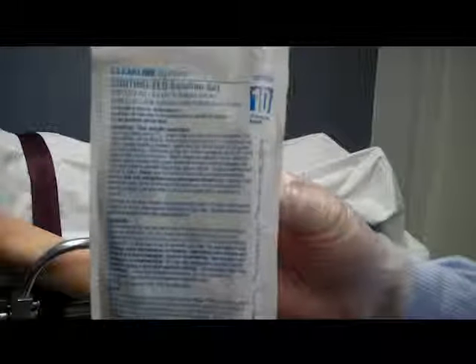The set we will be using is a macro drip set. This is rated at 10 drips per milliliter and is used for most IV therapy situations. I want to make certain the packaging is not torn or open. The caps are on each end of the administration set and the set is not past its expiration date.